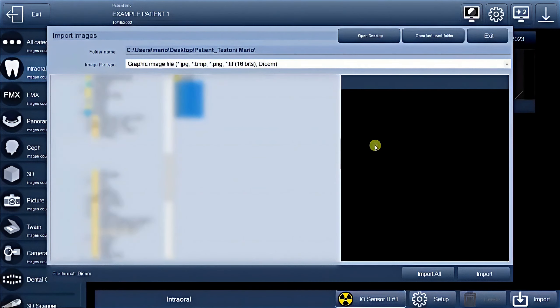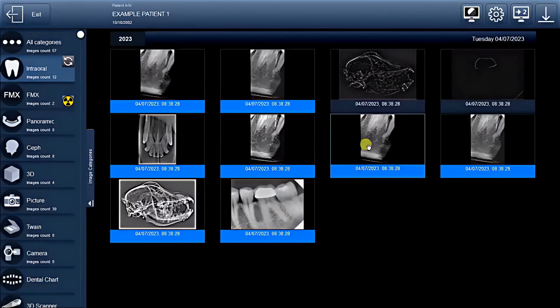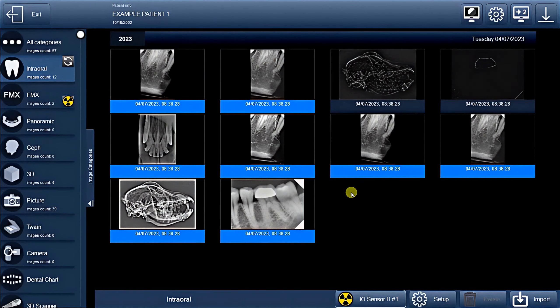After making your selection, the images will be automatically imported into the intra-oral function, making them readily available for your use.